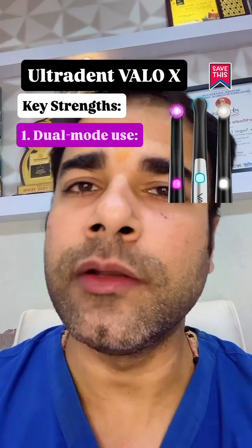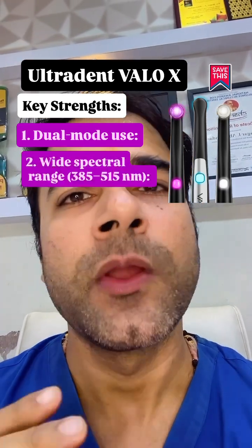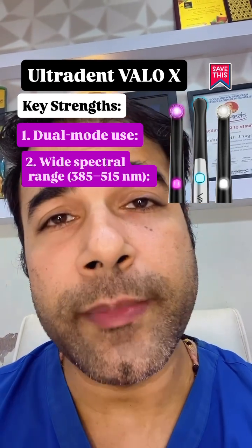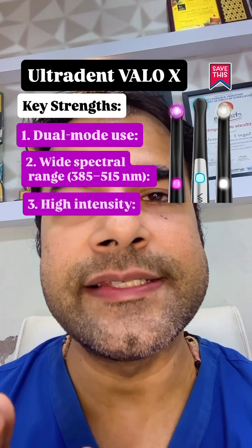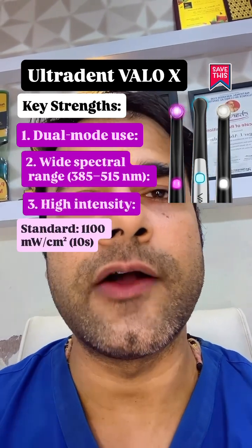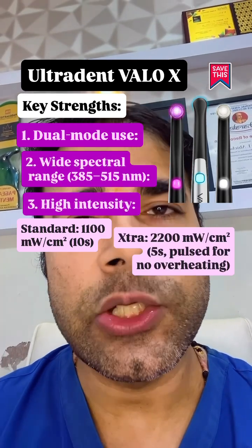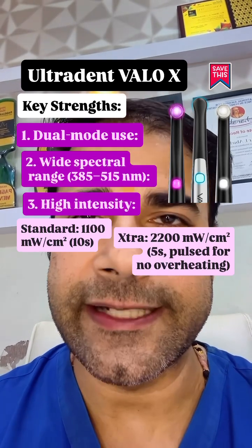The key strengths: dual mode use — cordless or corded — so you're never stuck mid-procedure. Wide spectral range from 385 to 515 nanometers cures all materials, even non-camphoroquinone composites. High intensity: standard 1100 mW/cm² in 10 seconds, and an extra 2200 mW/cm² in 5 seconds pulsed with no overheating.